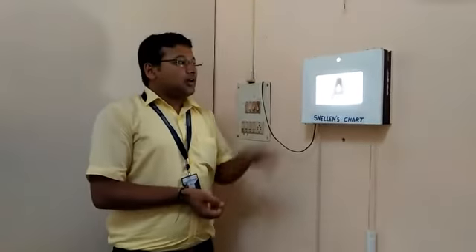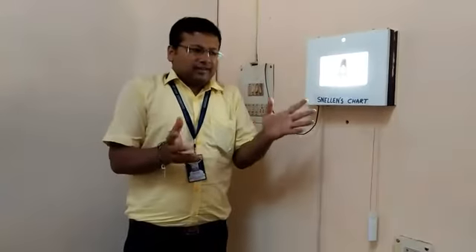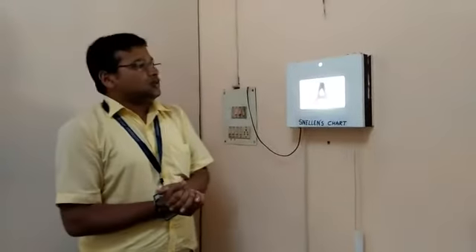But if the patient can't read the top letter at 1 meter distance, then how to check the visual acuity of the patient? For that condition, you have to hold up fingers at any distance which is less than 1 meter. If the patient can count the fingers from, say, 50 centimeter, then his or her visual acuity is recorded as CFCF 50 centimeter.